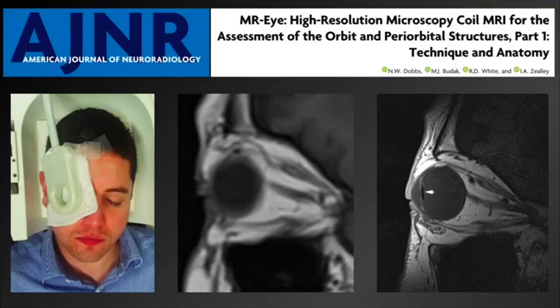Here's an article I'd like to commend to all of you — it's just out in AJNR this past July. These authors used a dedicated coil for the eye, which helps generate much better spatial resolution, as shown with their sagittal T1-weighted images. This is the whole brain, and this is using their dedicated eye coil, where you can see the lens replacement quite nicely and the spatial resolution looks a lot nicer. I will be borrowing some images from this article.